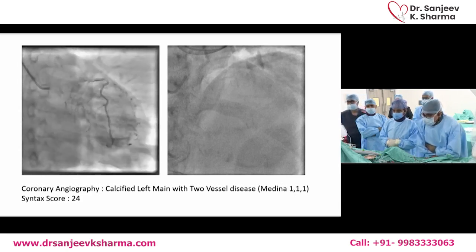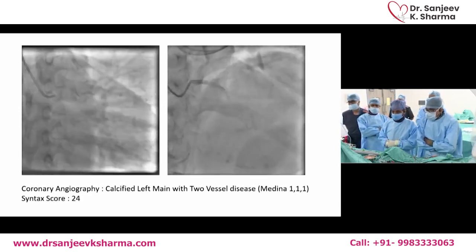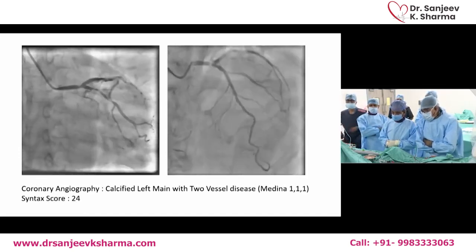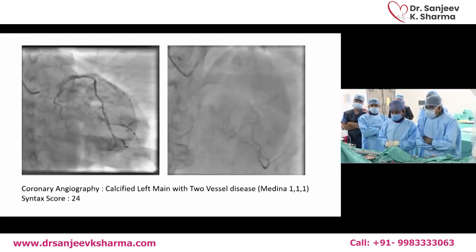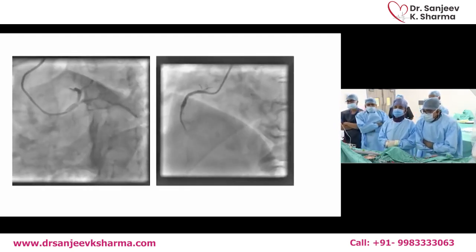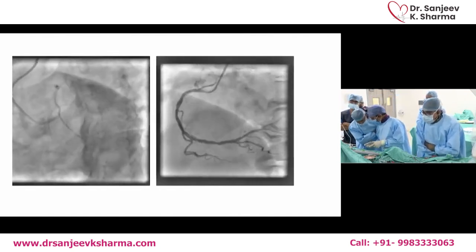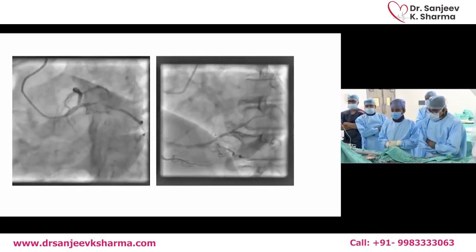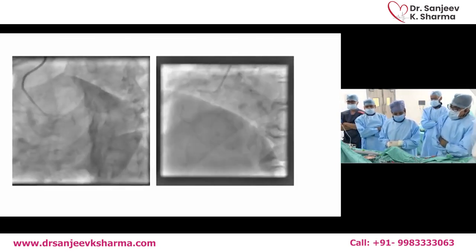Now we can clearly see the diagnostic angiography. Left main is tapering down in the distal segment, and that is encroaching upon the LAD and circumflex ostium. The circumflex is continuing as a large OM, with 90 to 95% long segment disease, right from proximal to mid segment. Go to the next view, please. In the LAO caudal view, we can clearly appreciate a tight distal left main stenosis reaching to the ostium of the LAD and the circumflex. RCA has moderate disease, 40 to 50%. So it's a typical left main bifurcation, Medina 1,1,1, a fibrocalcific lesion. And we did the imaging for that.